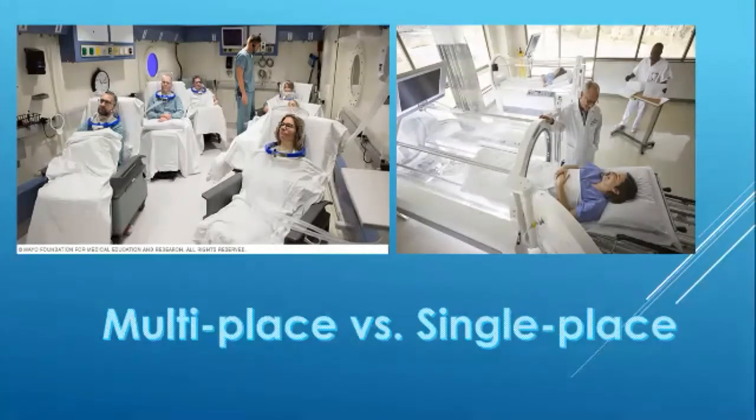Okay. On this side is the monoplace or single place, right? And now, he's the only one, or she's the only one who can go in there. So this is pressurized with oxygen. So she won't need an oxygen cannula. She doesn't need a mask, none of that. Because when we put her in there, we're going to seal it up and bring the pressure up using oxygen. And that way, she's the only one being affected. And the other people will stand on the outside and look in. Okay? That's the difference between the single place and multi-place chamber.